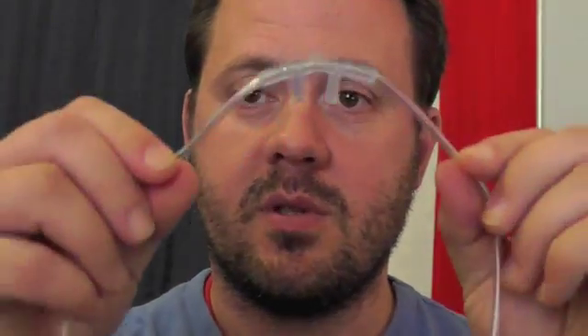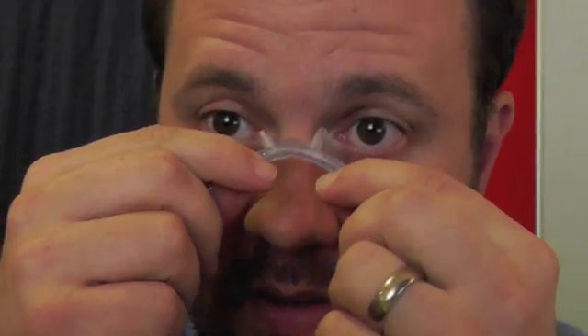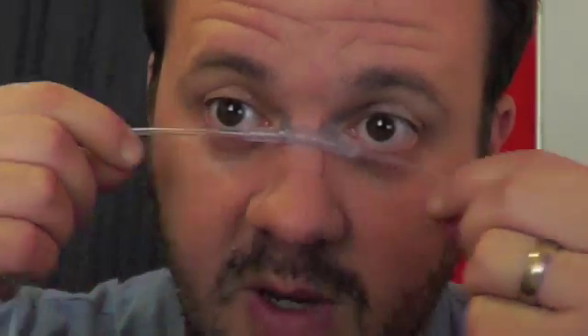Basically, if you get a patient with a chemical splash to the eye, an alkali or an acid splash to the eye, especially if both eyes are involved, or patients who've had flash burns, or foreign body scratches who need their both eyes washed out simultaneously, all you do is you grab a pair of simple nasal prong oxygen cannula like this, and you just sit them up across the bridge of the nose, like that.